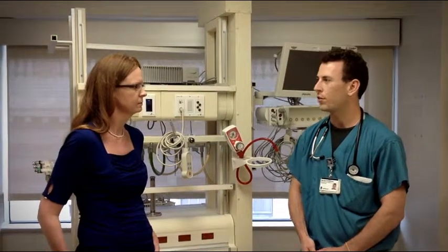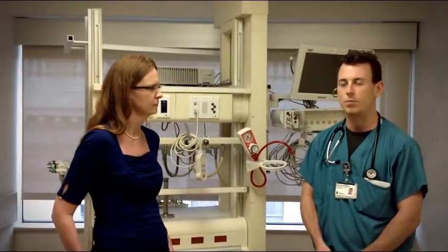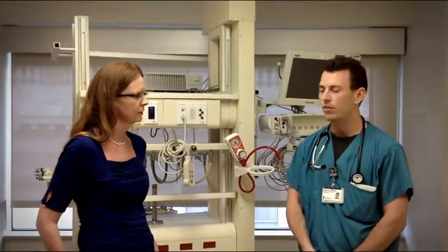So the most common mode that we use when intubating someone is called assist control, and that is a mode where you use volume, and every breath the patient gets is a set volume, and that is based on their height. So if it's a morbidly obese patient, you don't go by their weight, it's always by their height. And that mode does all the breathing for the patient. You can have a set rate, so if someone has a set rate of 12 on the ventilator, they will get 12 breaths, but they can also breathe over that set rate, so they're not locked in, but they're always going to get that 500 or whatever their tidal volume is.